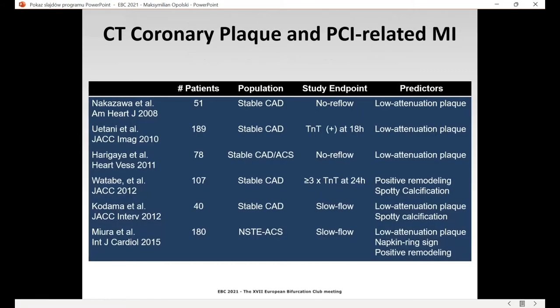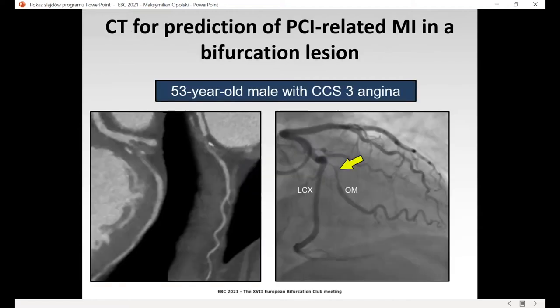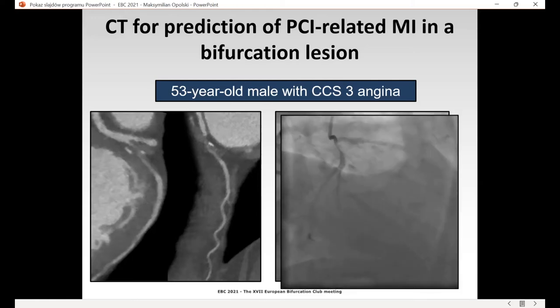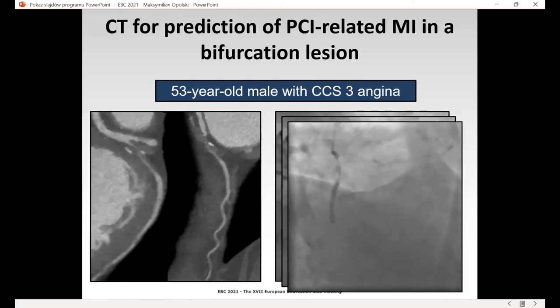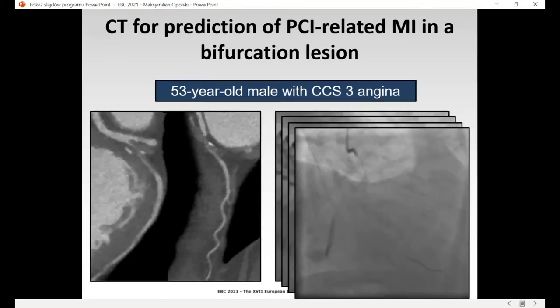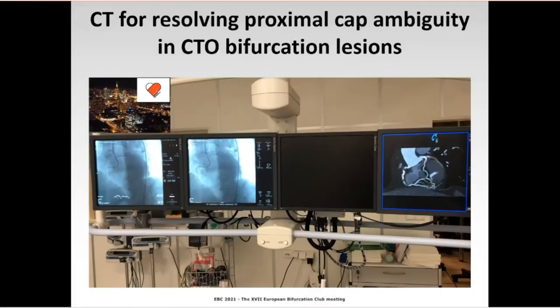Number three: there is a large body of studies suggesting a direct relationship between low-attenuation plaque, positive remodeling, and spotty calcification, and periprocedural MI defined by troponin rise or no-reflow phenomenon during PCI. Here you can appreciate this ugly-looking low-attenuation plaque with positive remodeling and spotty calcium that was referred for PCI. After stent implantation, the no-reflow phenomenon was observed and subsequent troponin rise was reported.